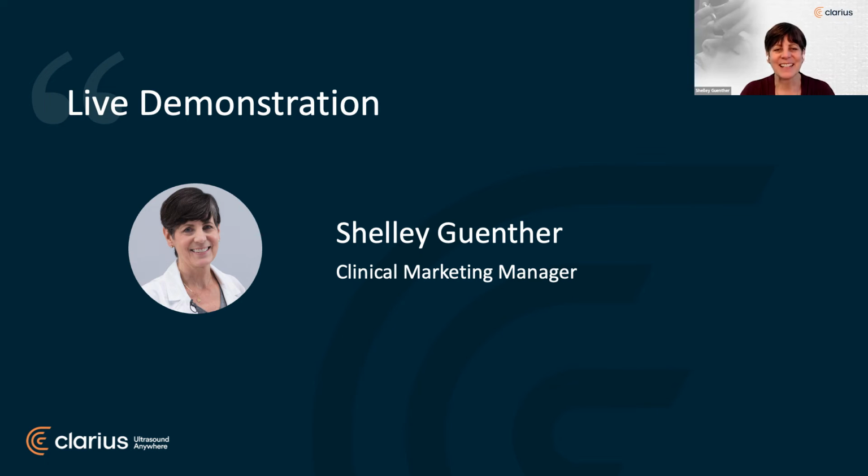Excellent. Yes, and we love having you join us for these webinars, Dr. MJ. Great. I'm so excited that you're offering this course and especially this most generous offer to Clarius users. I'm going to pop over to my Clarius L20 and just do a little bit of live scanning. My favorite.